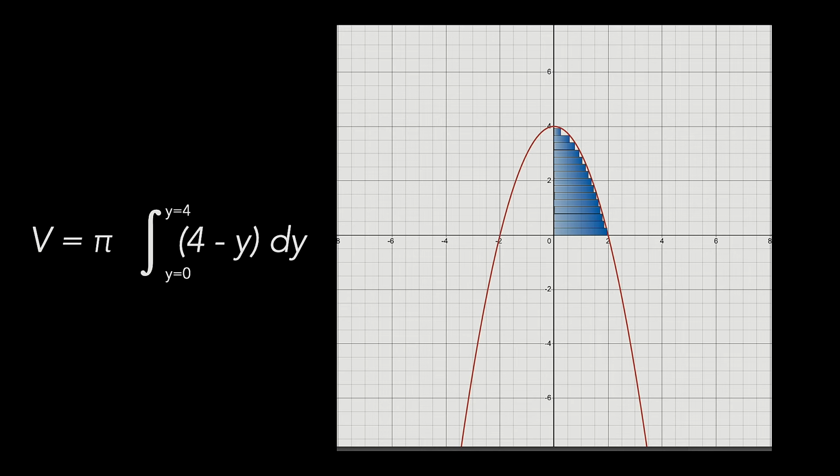It creates these volumetric disks mathematically, stacks them one on top of each other to approximate the interior dimensions of this left ventricle, and measures it in systole and measures it in diastole. We put up the integration here just to show how mathematically it could work, but essentially that's what's happening. The machine is taking this data and calculating volume out of these stacked coins or stacked disks, in its largest diameter, in its smallest diameter, and those are volumes, right?